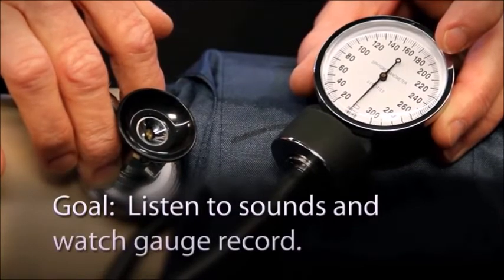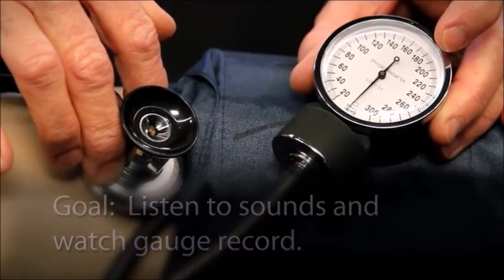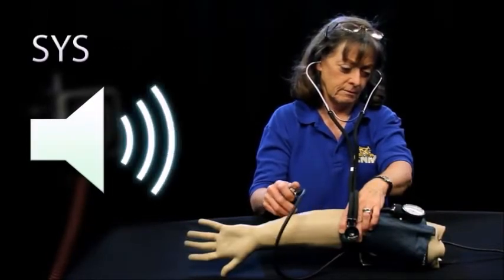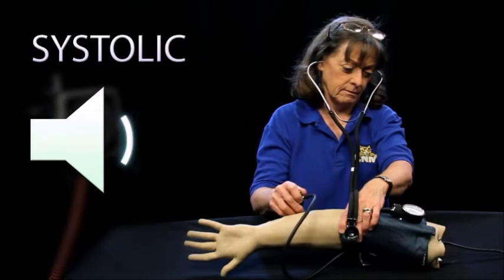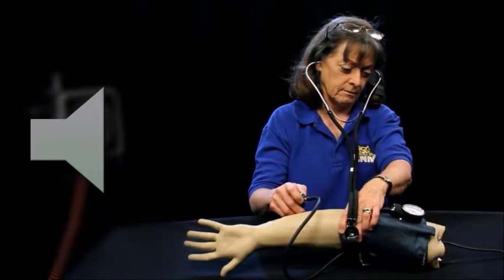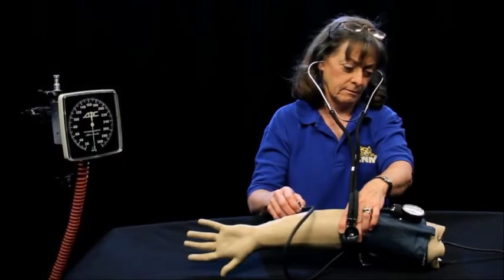Practice is to coordinate what you hear with what you see on the gauge. You will listen for the first sound which is the systolic blood pressure. Next, listen for when the sound stops. This is the diastolic blood pressure. Then write down your measurement.